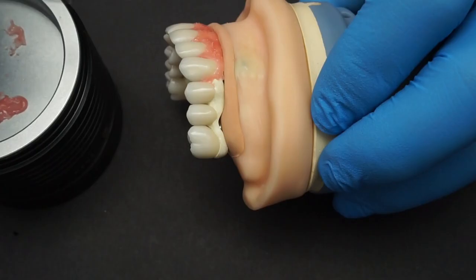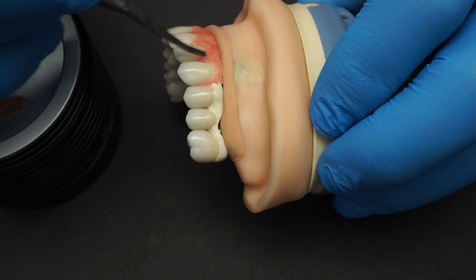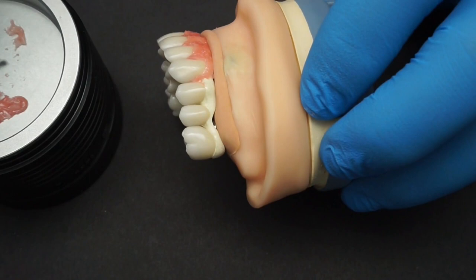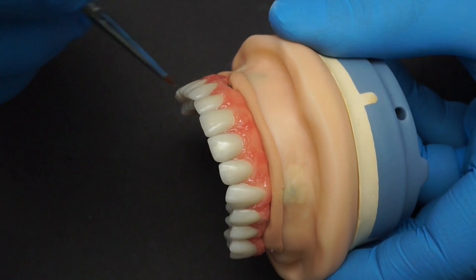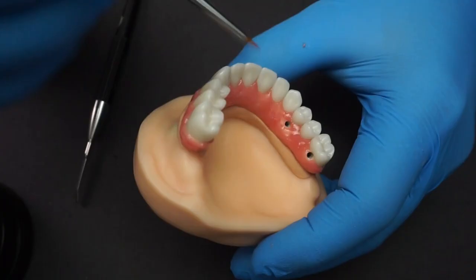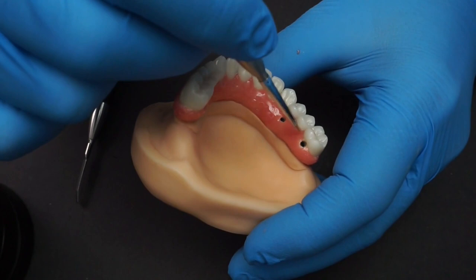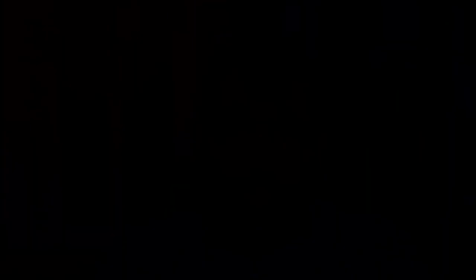Here you can see I'm adapting the gingival contour around each tooth because it's important to have nice clean margins, adding a little bit more composite to give it more texture and bulk. Once you've done one tooth, you simply move on to the next area and keep adding without any changes. Once you've finished all the way through, before curing I'll go through the whole thing again to make sure it has been properly textured with a nice margin. I'm doing the same on the palatal surface, taking care not to close off any access holes for the implant screws.